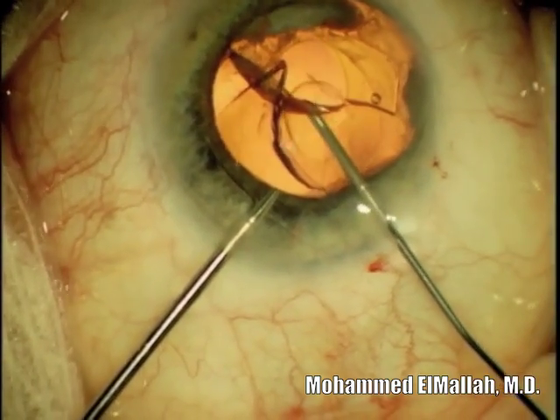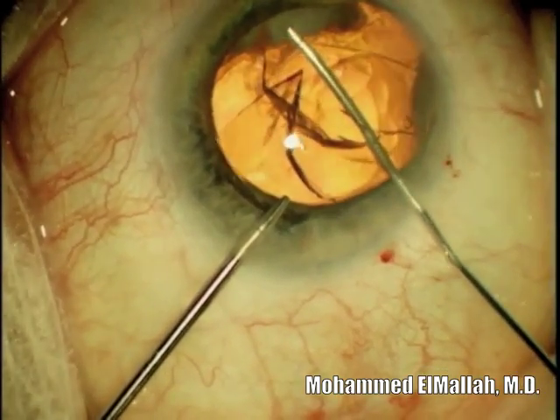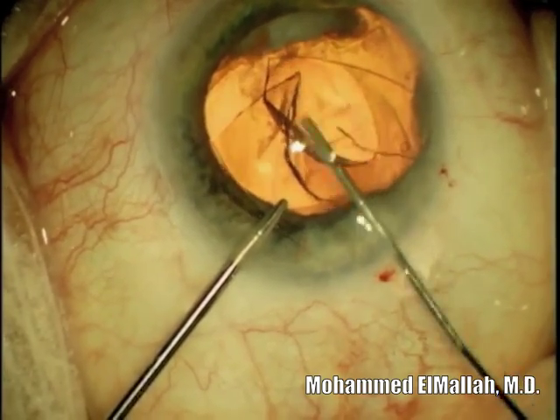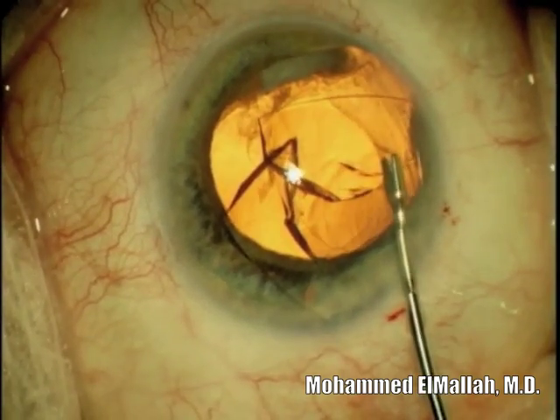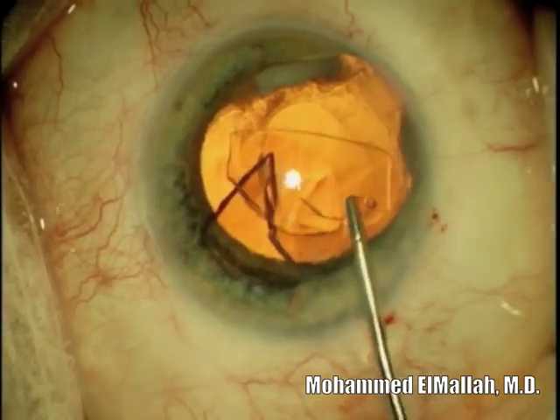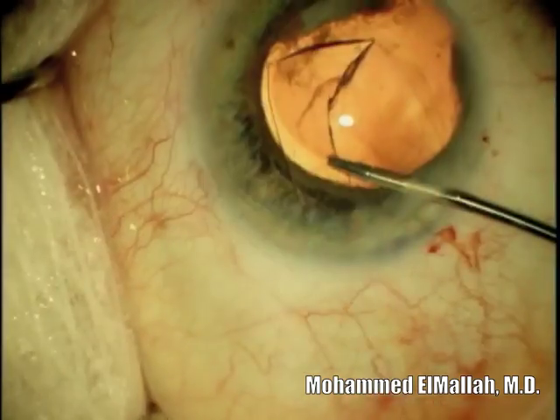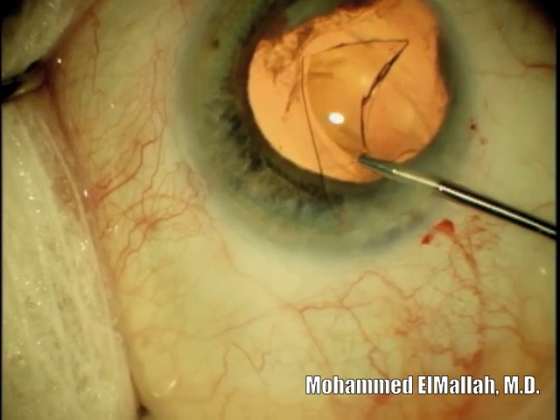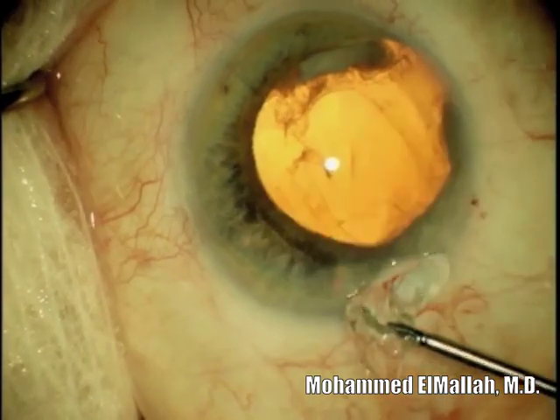Here, more Viscoat is injected behind the lens fragments. Finally, the remaining IOL fragments can be removed from the anterior chamber. It is noted that the iris defect persists inferiorly, and in fact, the iris has scarred into the angle.